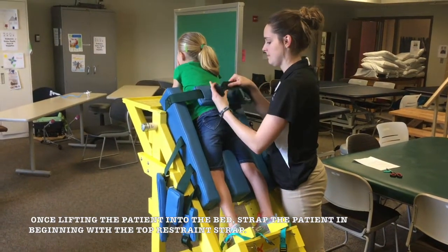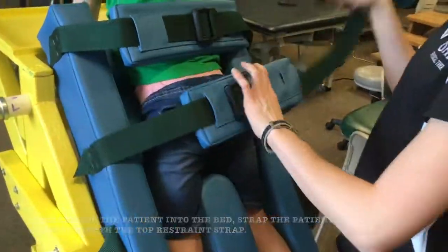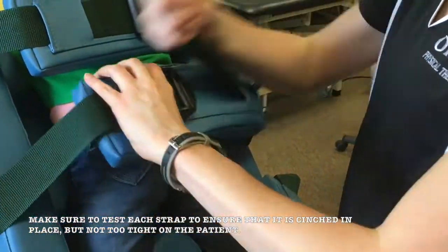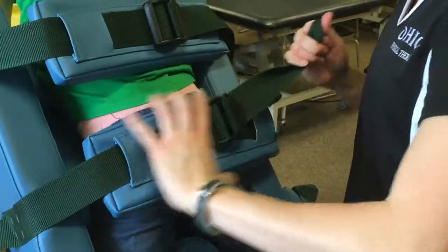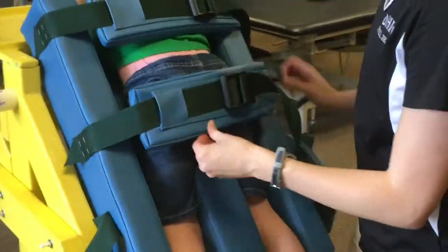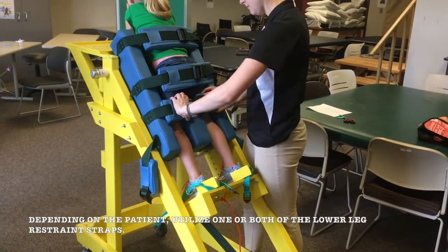Once lifting the patient into the bed, strap the patient in beginning with the top restraint strap. Make sure to test each strap to ensure that it is cinched in place but not too tight on the patient. Depending on the patient, utilize one or both of the lower leg restraint straps.